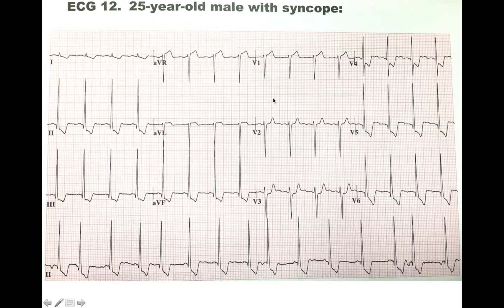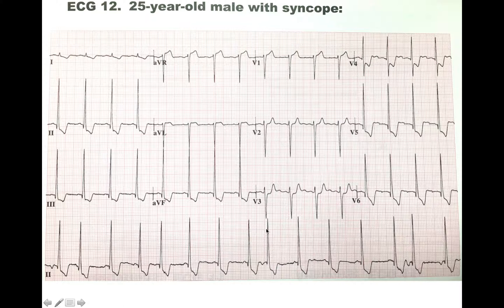Then you go ahead and scan the EKG. Looking at the lead 2 strip, I can appreciate some atrial premature complexes here, here, here, and here. So you can appreciate some atrial premature complexes on lead 2.